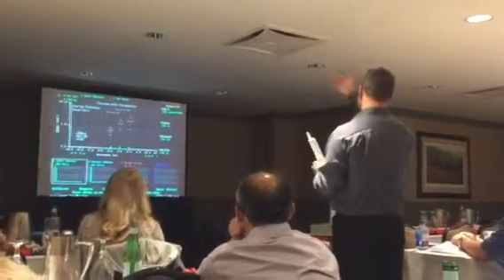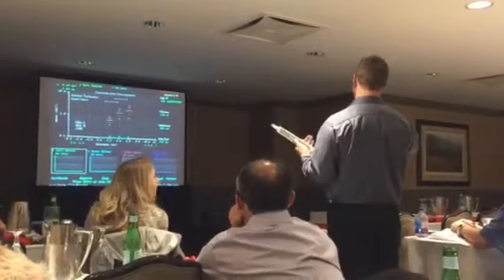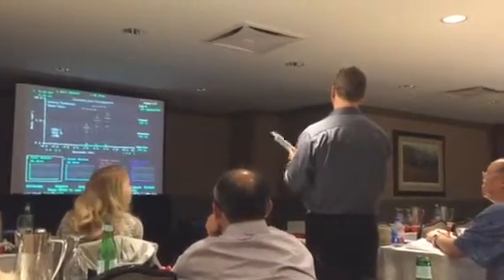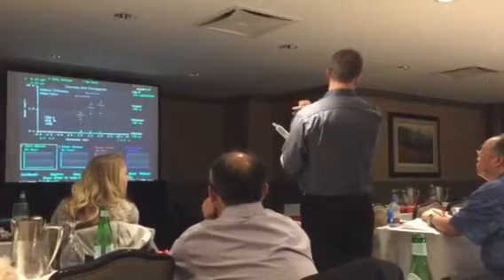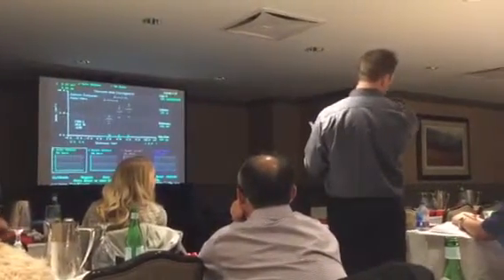As I'm doing that, you're going to see the lines on my graph show up, and they're going to start being very sporadic all over the place — going up and down. And then after about three seconds, I'm going to pause breathing. And when I pause my breathing completely, my lines are going to slowly come together. And that's when I'm going to try and stop my test so I can get an overall average on my airway side.